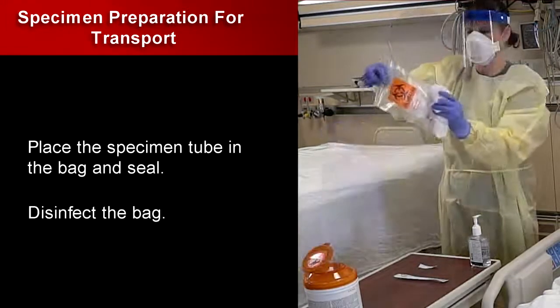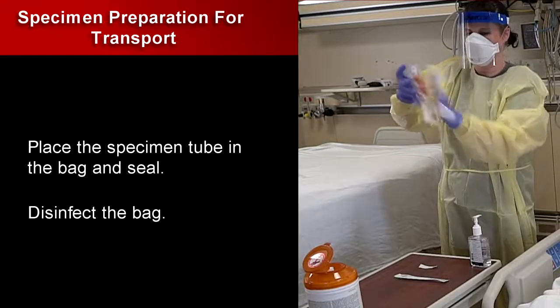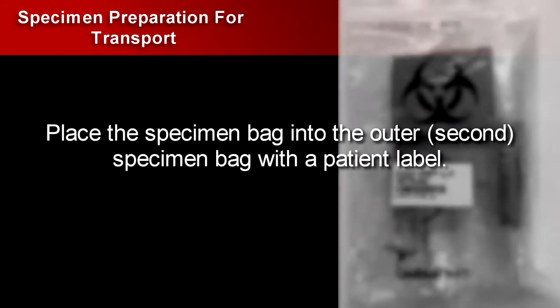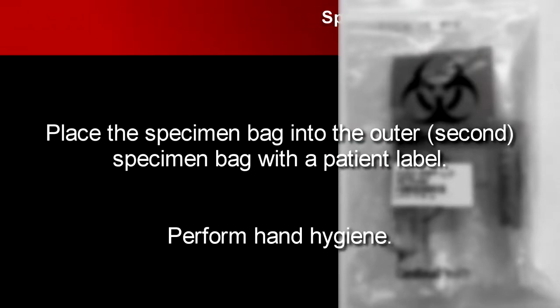Disinfect the specimen bag with disinfectant wipe. Place the specimen bag into the second specimen bag with a patient label. Perform hand hygiene.